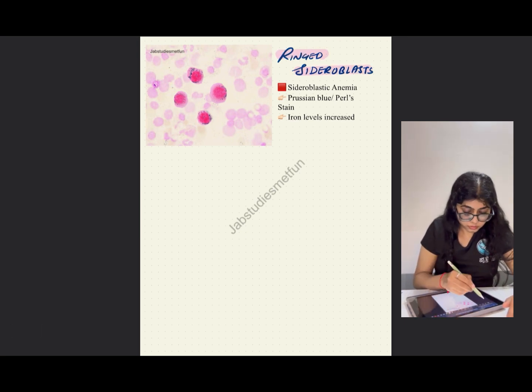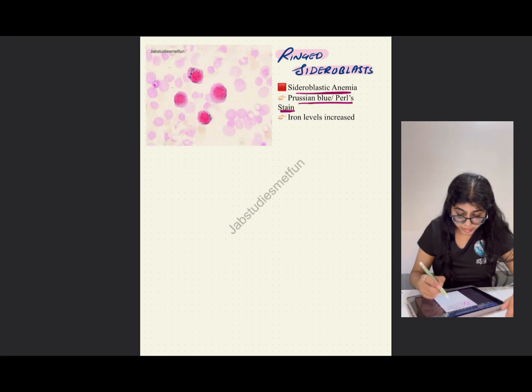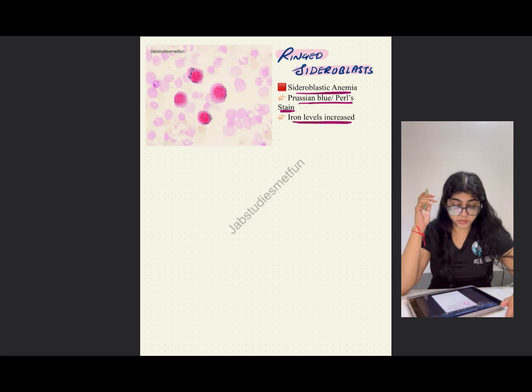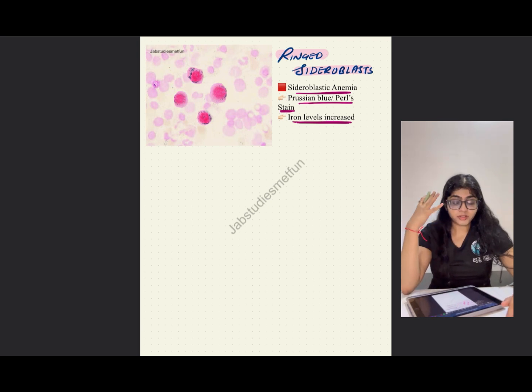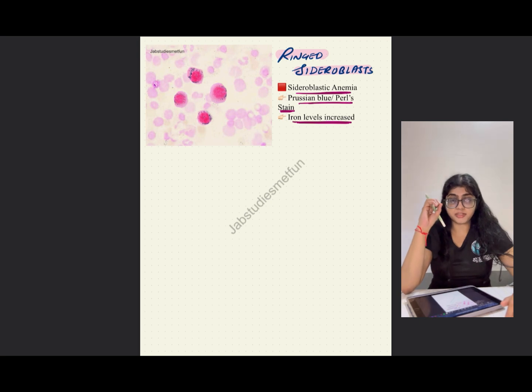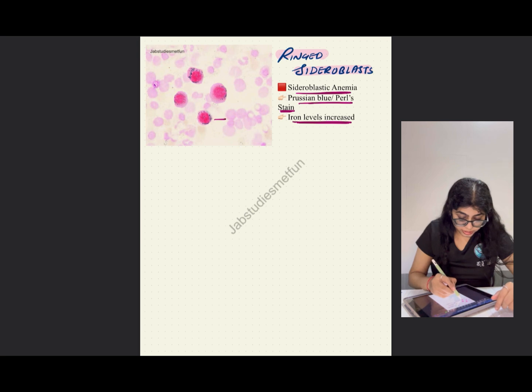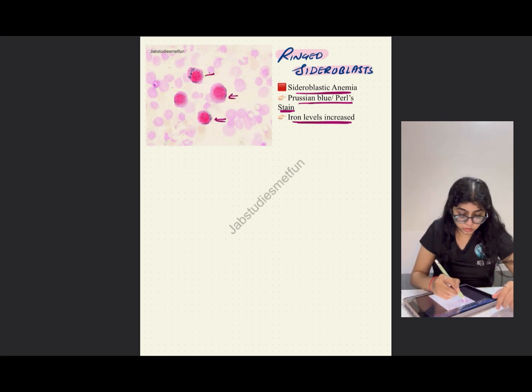Ringed sideroblasts are seen in sideroblastic anemia. The stain used is Prussian blue or Pearl stain, and the iron levels are increased. As mentioned, Pearl stain or Prussian blue stains for iron, so when iron levels are increased, you can see the ringed sideroblasts. A ring of iron is formed around the chromatin.